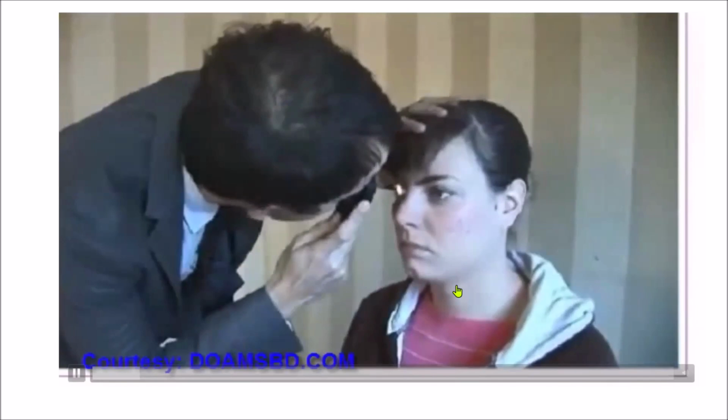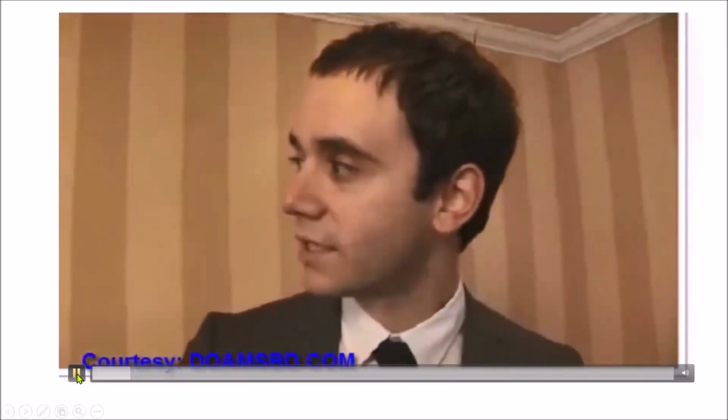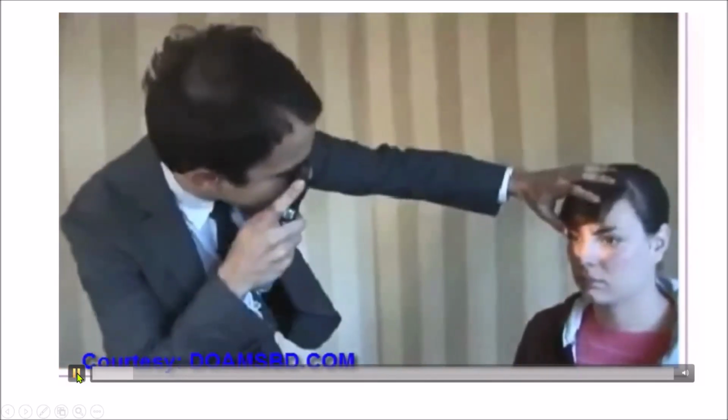Just to interact here, Dr. Azra, did you understand what the instructor actually said to the patient? Yes, sir. Very nice. Just a little far away, around 30 centimeters, focusing and then coming closer to the eyes. Just there, imagine you can see through me. Can we please have the lights dimmed? I'm just repeating, you see, from there.